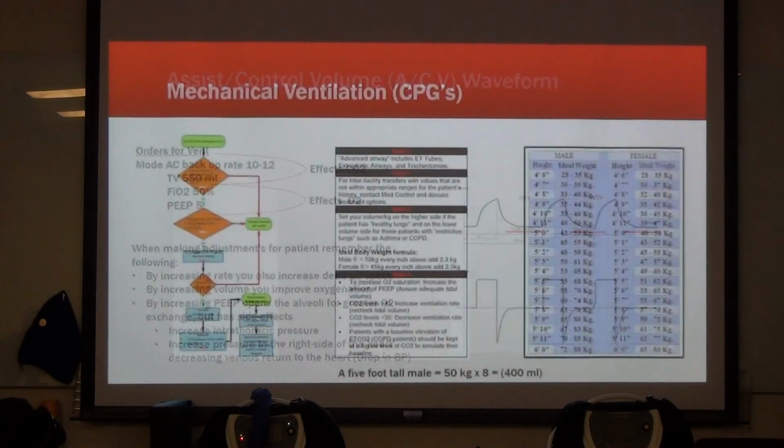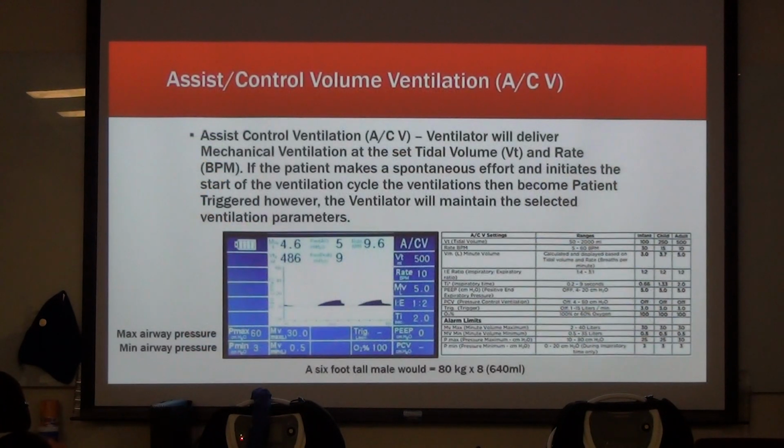All right, let me go back here for a second. Question on assist control. We know this is a volume-generated delivery method, right? Let's do some examples. Can assist control work with somebody that's on propofol that has their own respiratory drive, but is just mildly sedated?